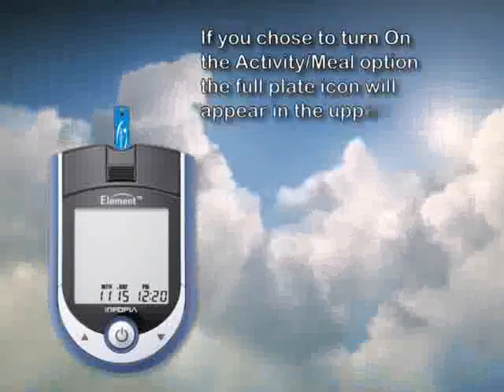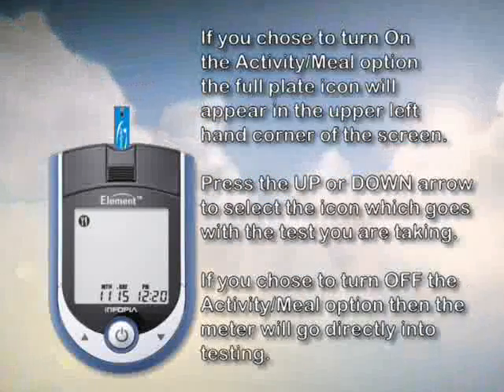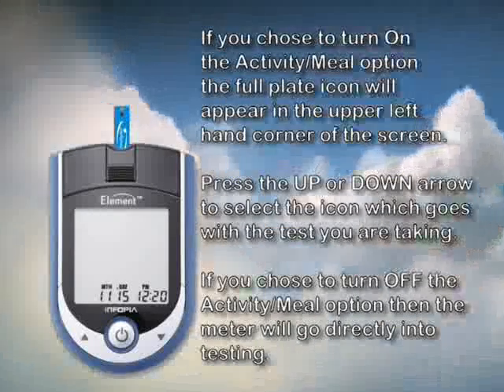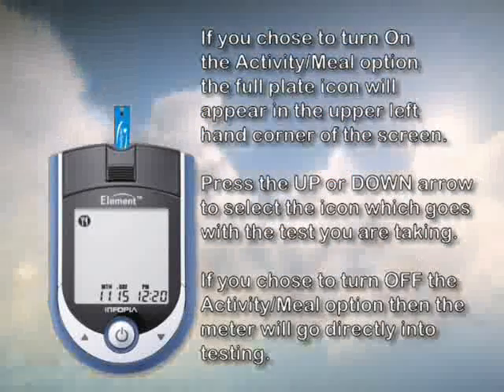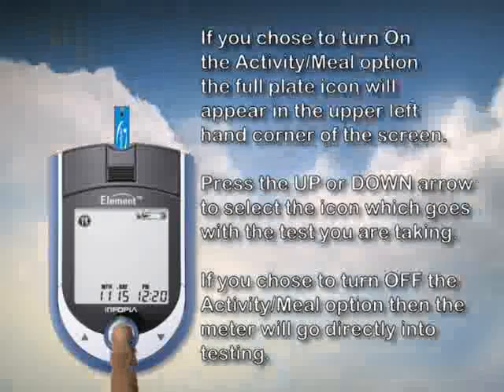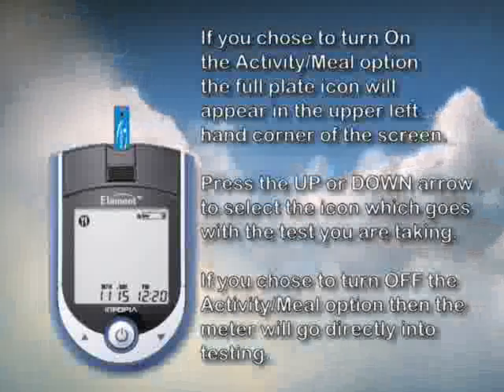If you chose to use the meal activity flag feature during the setup process, then the full plate icon will be blinking in the upper left hand corner of the screen. You must scroll through by using the up and down arrows and select which flag correlates with your blood sugar test. Then press the power button. A blinking test strip will now appear at the top and you are ready to test.